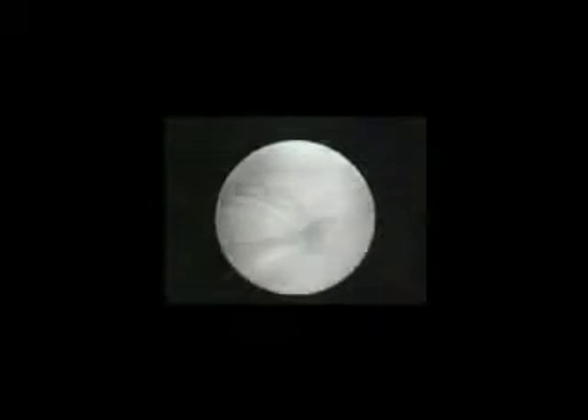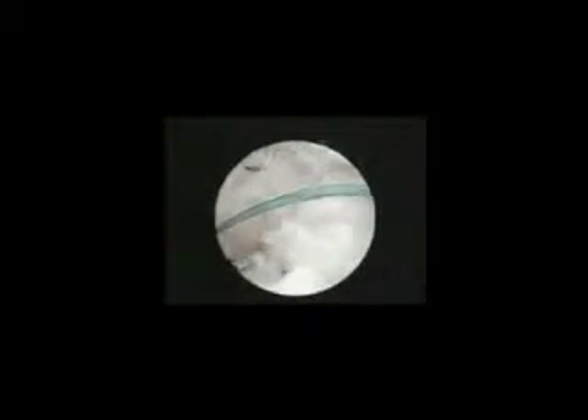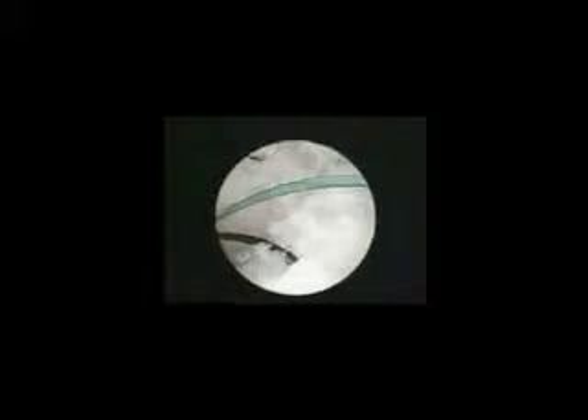Tension can then be applied externally to close the defect and also demonstrate restoration of the trampoline effect. The suture is now ready for welding.